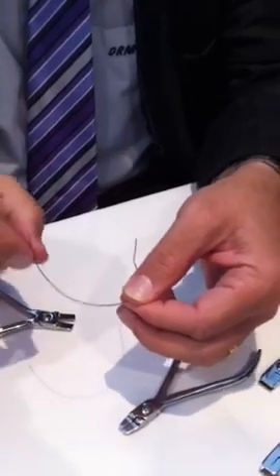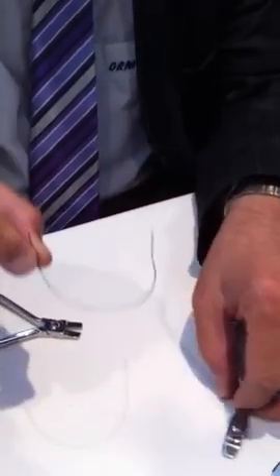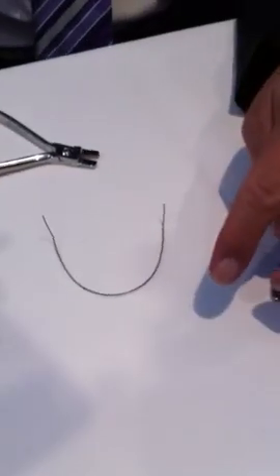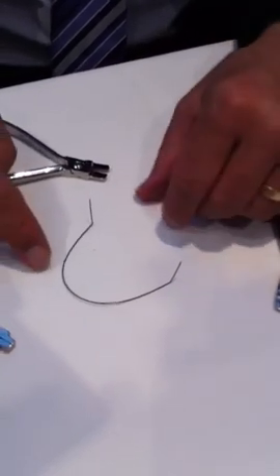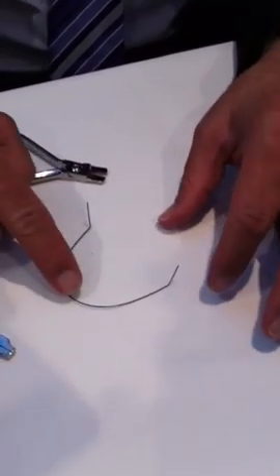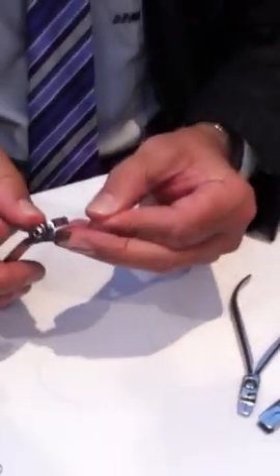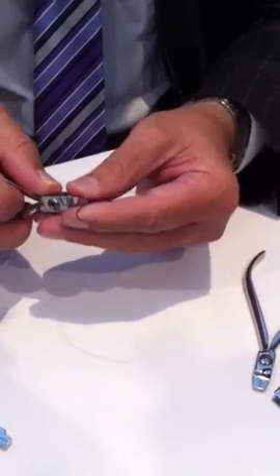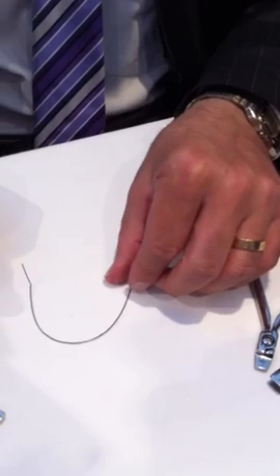The first thing you should do before you go around the other side is to flatten the wire. If I put this down, you can see that it's rolling — that means I already have unwanted movements in the wire. To take that roll out, I come back to where it's riding high and simply, at the same place I placed the torque, flatten the wire. You can see then that it's lying in a bit of a better state.